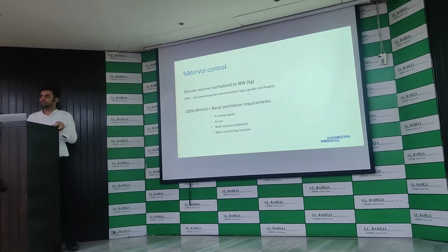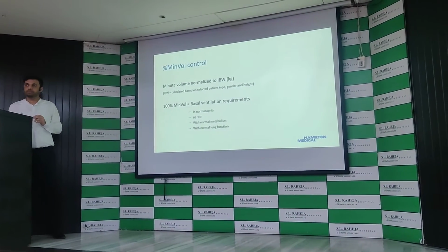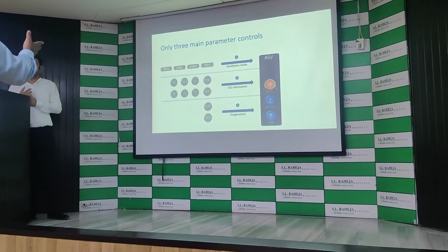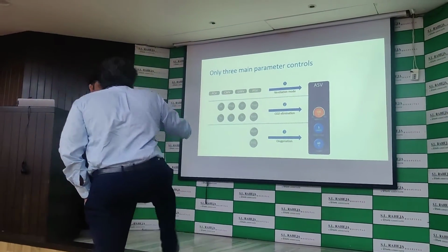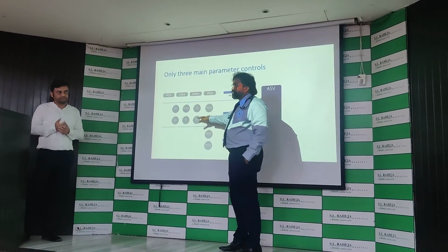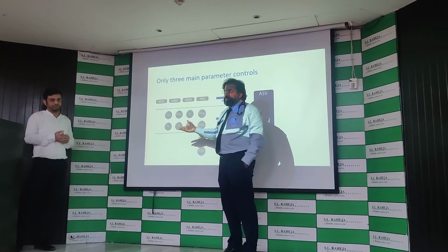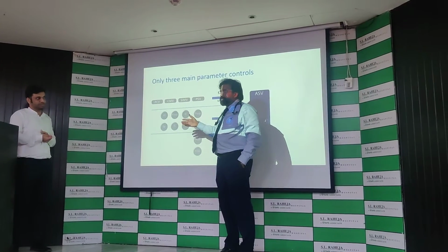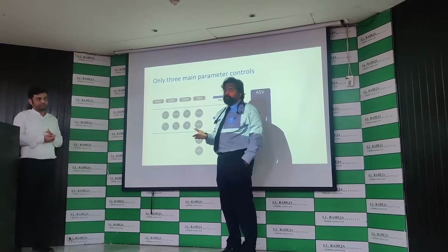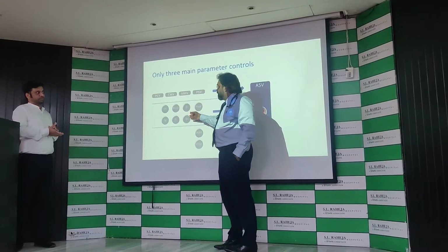Moreover, in the conventional mode, you may need to set this three times in the day. Importantly, if your patient goes from low compliance to high compliance and back to low compliance, I need to set this again. I see my plateau pressures, I need to set it again. I see my peak pressures, I need to set it again. I need to do it at least 3 to 4 times in the day. Our patient does not stand straight, it actually moves, so that is why I need to set it again and again.